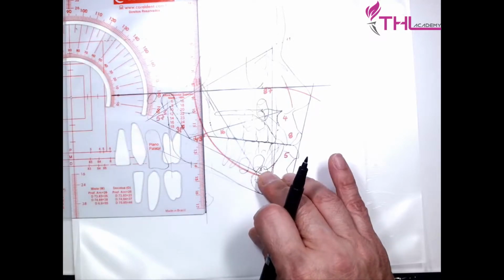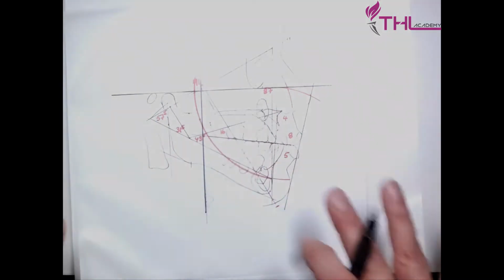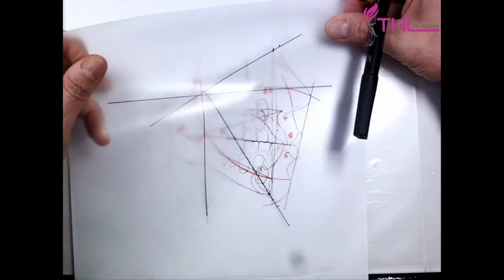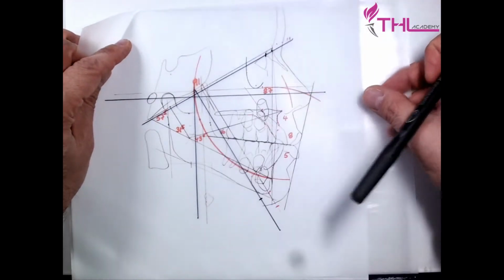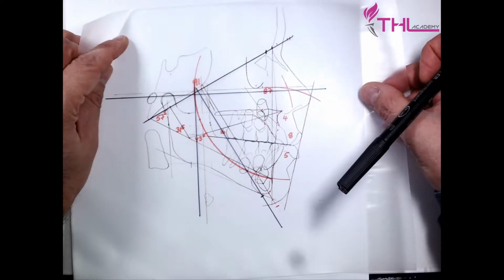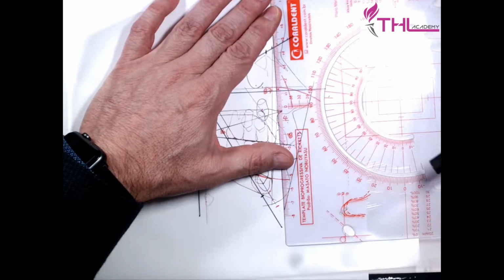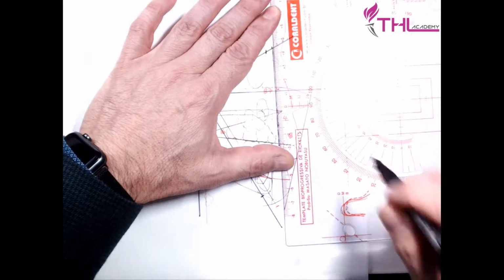Okay, now I am going to put 5.6. I put back my sheet of paper and I coincide with the nasal plane. Now I can copy the new nasal plane.